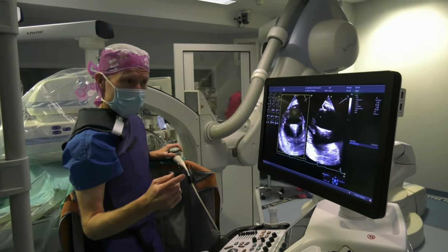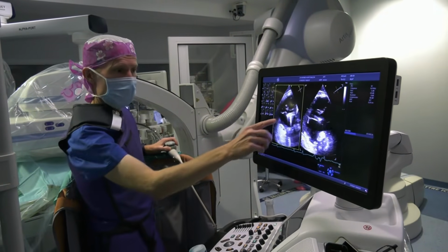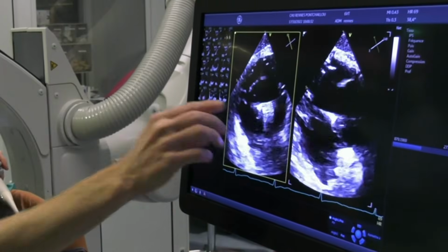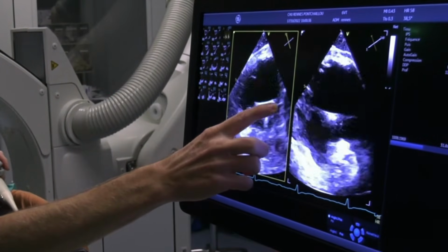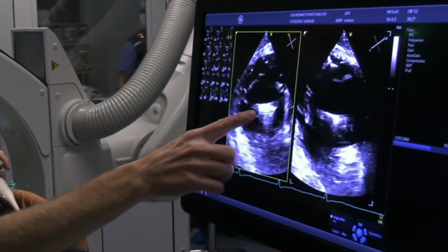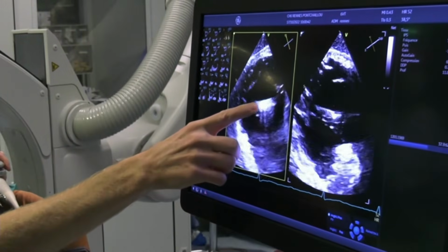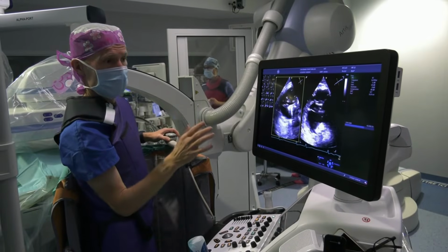As has been mentioned by Guillaume, you see that now we are in the right ventricle. The arms of the clip are open, and you see that we are very close to the mid part of the septal leaflet, and we are probably catching the anterior leaflet with this arm. So it's quite nice because we are really where we want to be.